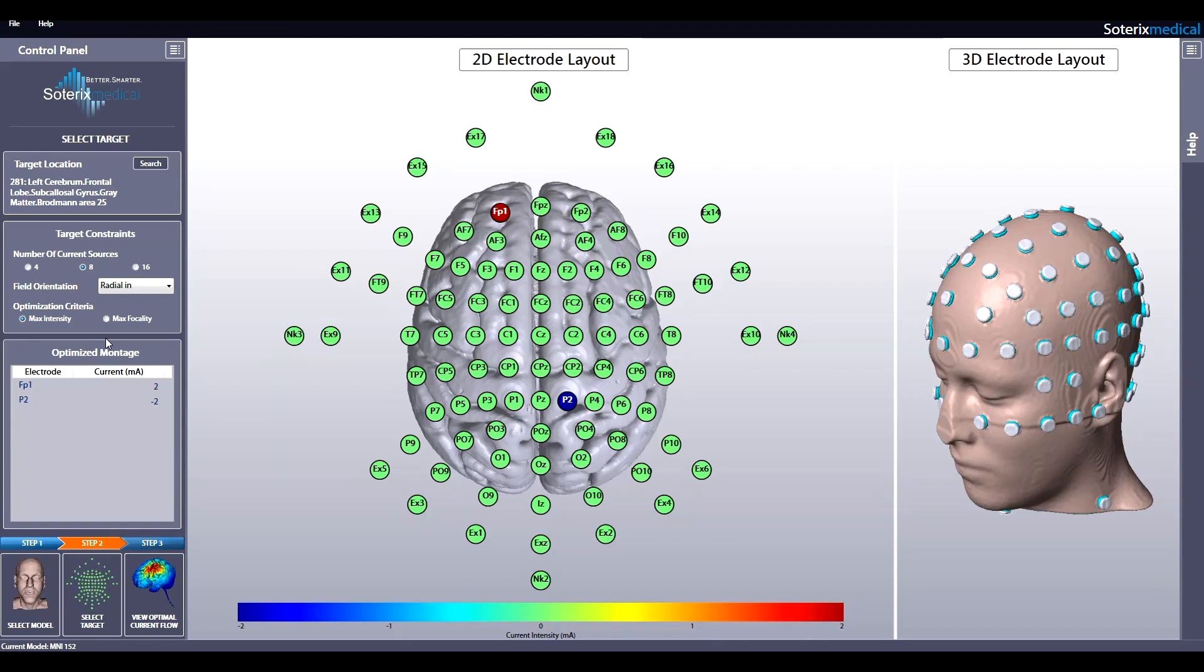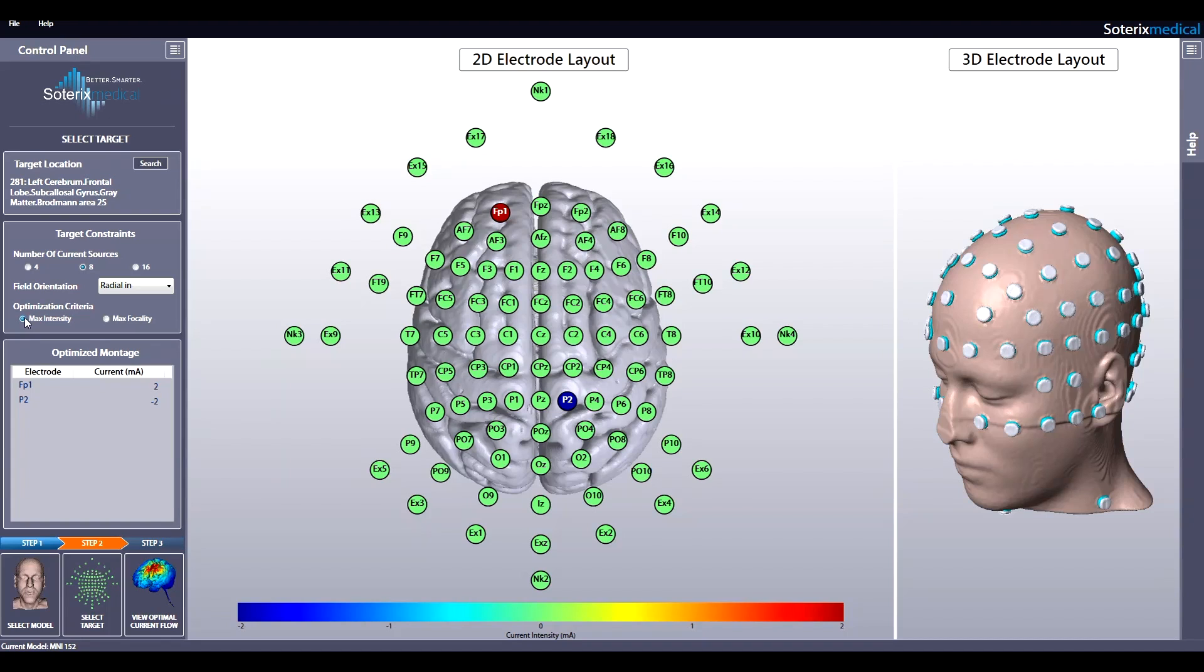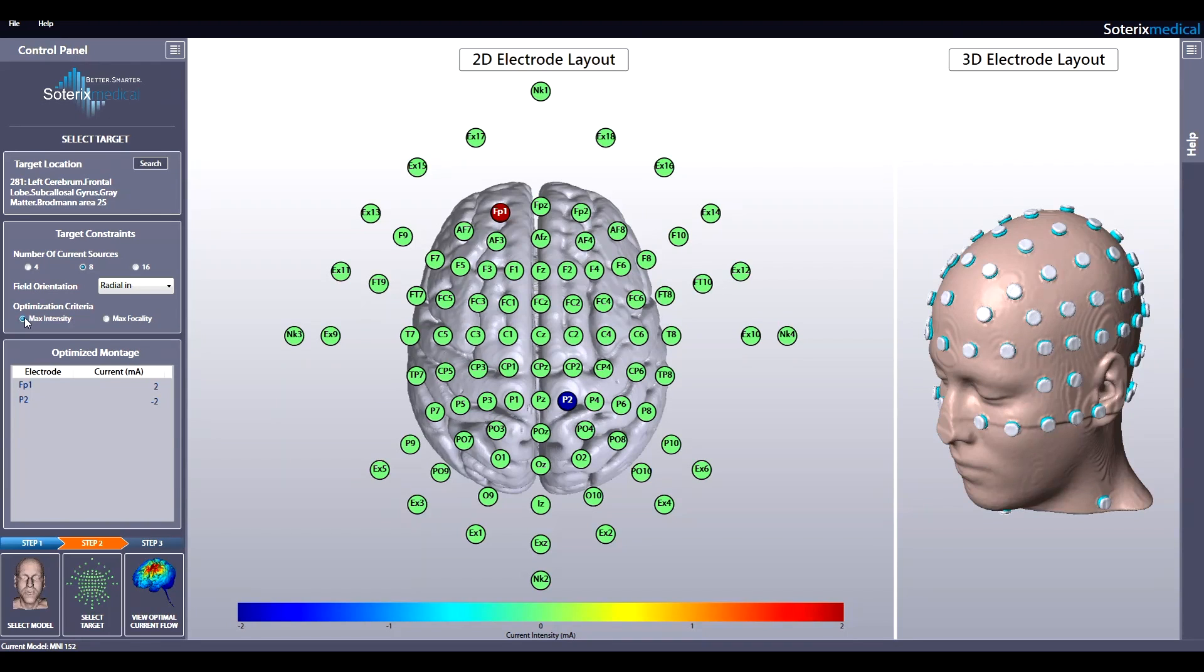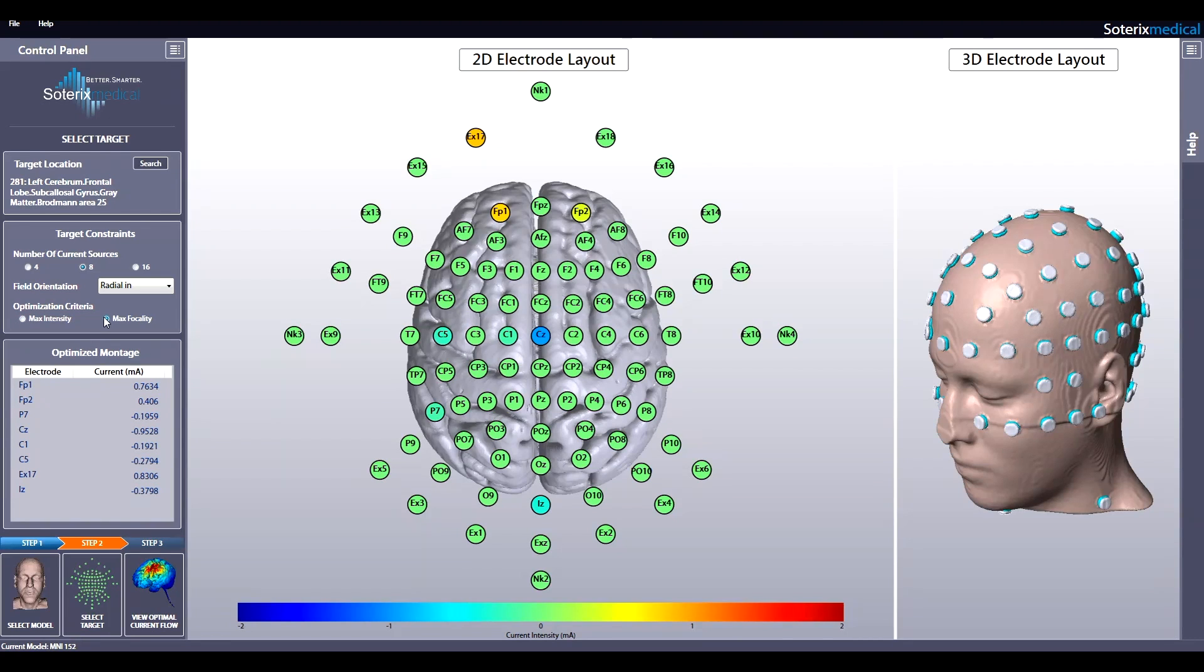Lastly, select your optimization criteria. You may choose to select maximum intensity, which delivers the maximum electric field to the desired brain target with limitation of 2 mA total of high current. Or you may select maximum focality, which delivers the maximum current intensity to the target while sparing the remaining brain regions. Let's select maximum focality.